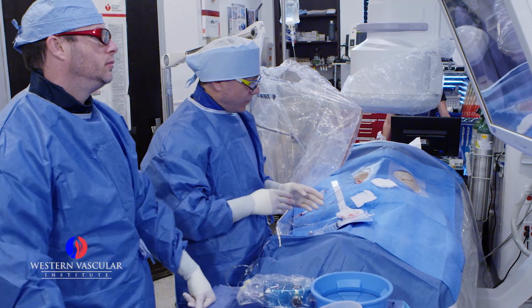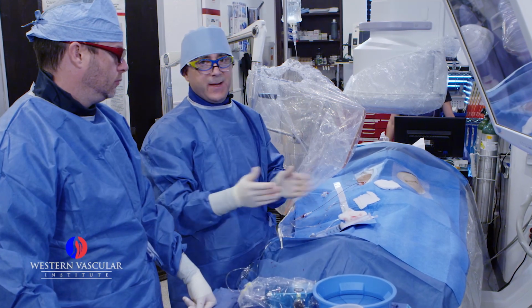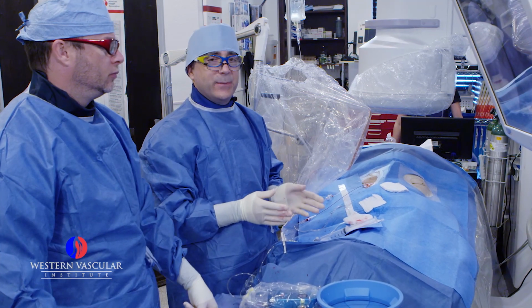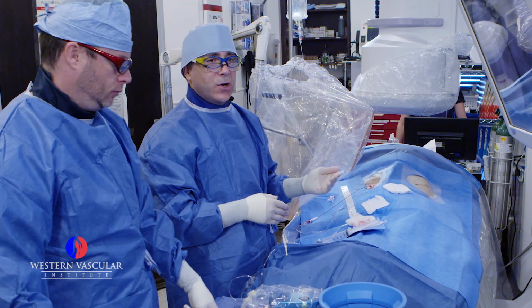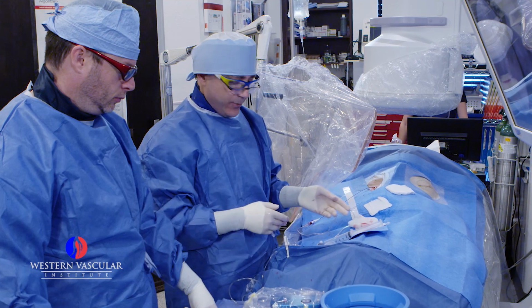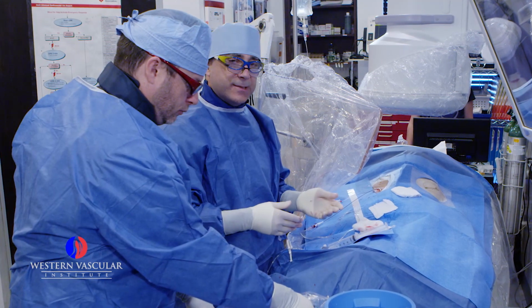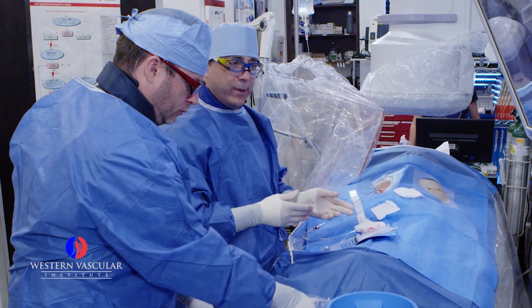Now, the difference with this case versus many of the other cases is that her kidney function is not the best. So we want to try and limit the amount of dye that we use, which can cause problems with the kidneys. So today we're going to use carbon dioxide. That will allow us to see the inside of the arteries and navigate where we need to go.